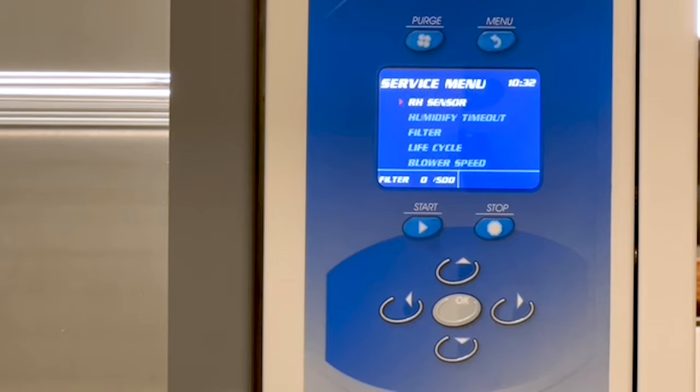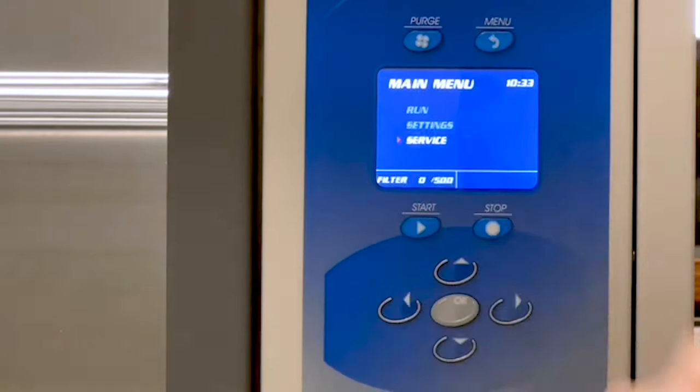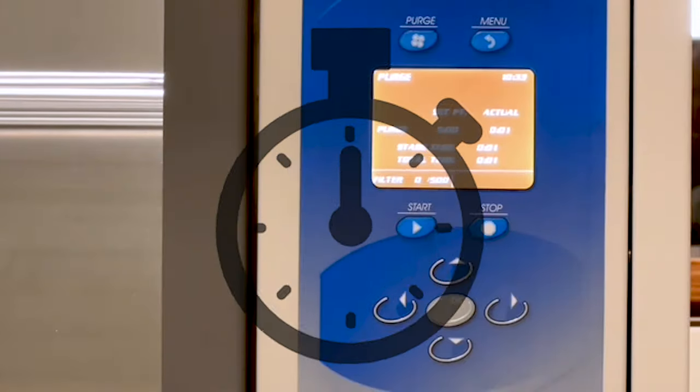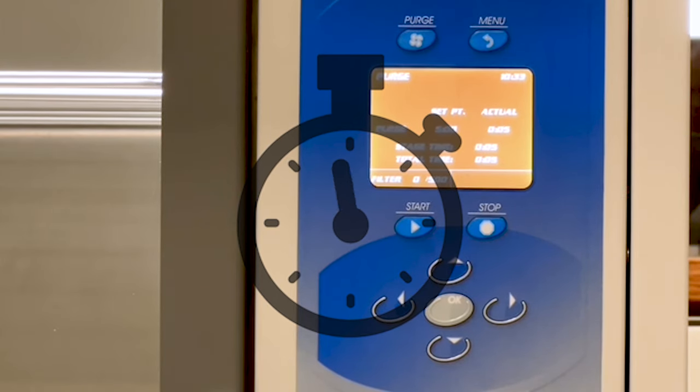To verify the calibration, press Menu to get to the main menu screen. Now press Purge and allow it to run for 5 minutes. This will remove the humidity in the chamber before going through the humidity process again to verify your calibration.